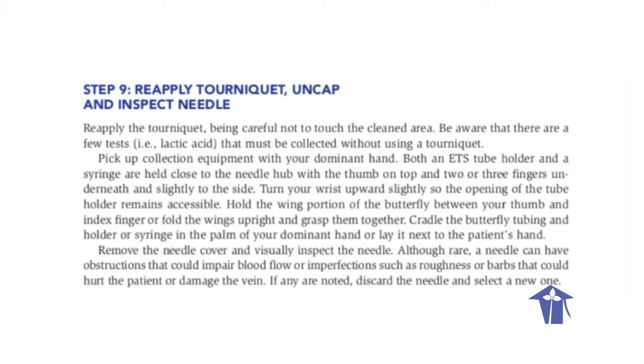Step 9. Reapply tourniquet, uncap and inspect needle. Reapply the tourniquet, being careful not to touch the cleaned area. Be aware that there are a few tests, such as lactic acid, that must be collected without using a tourniquet.